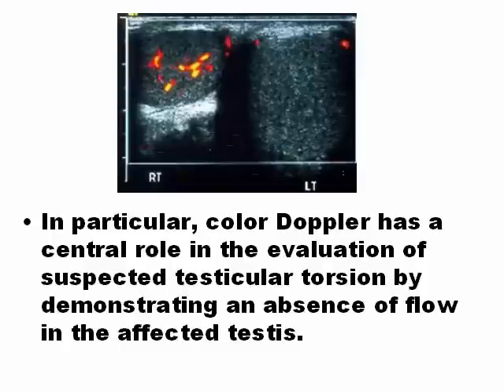Of course, color Doppler is very important. All testicular protocols must have color Doppler and also a spectral Doppler, which is more objective than color Doppler.